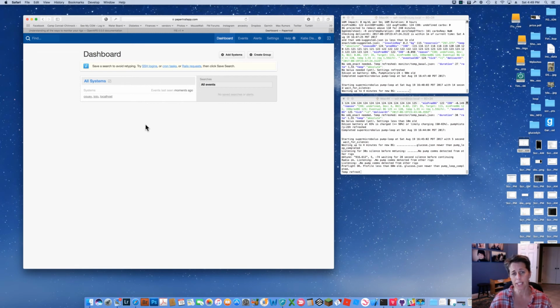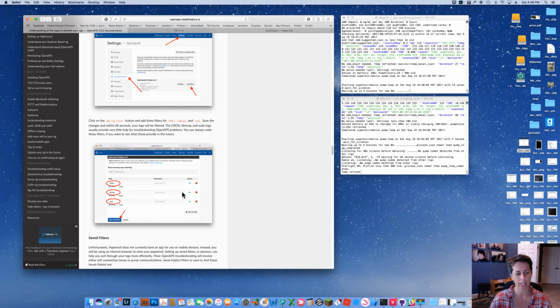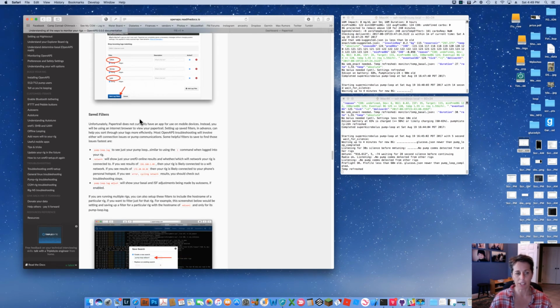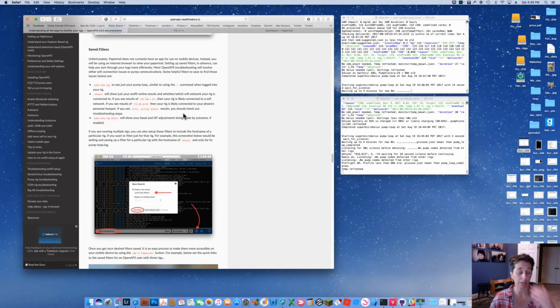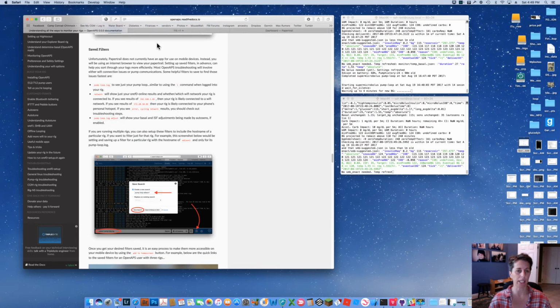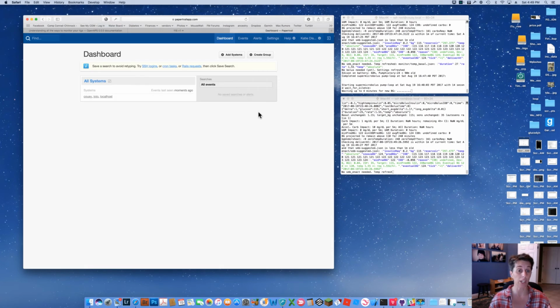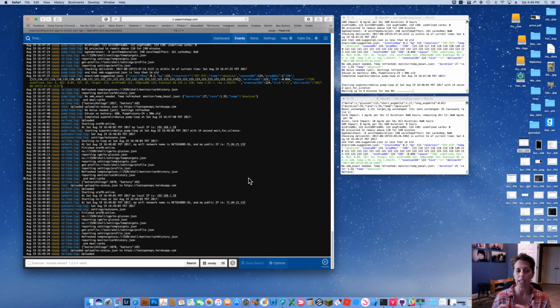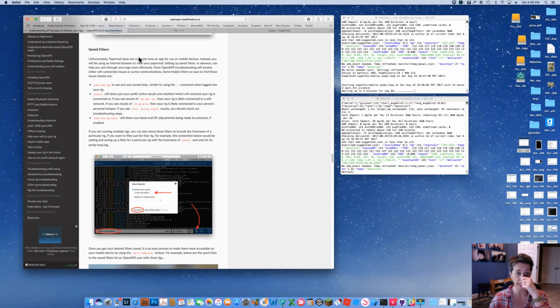The next thing we want to talk about is saved filters. So we saved log filters, but the other thing that's really important to realize is that the way the data comes into your Papertrail is simply a chronological order of all your logs that you've established. And when you set up Papertrail, it's taking network logs, Nightscout logs, CGM logs, pump loop, autosense, autotune.